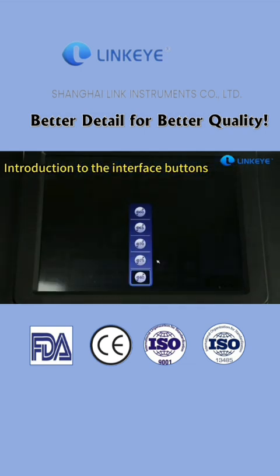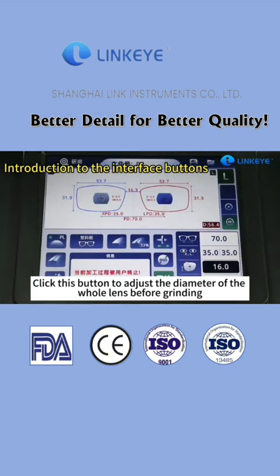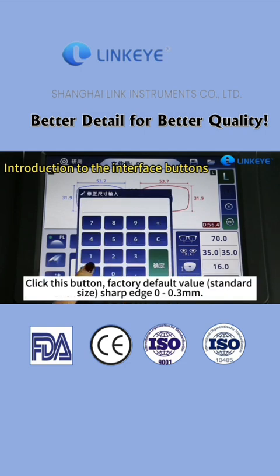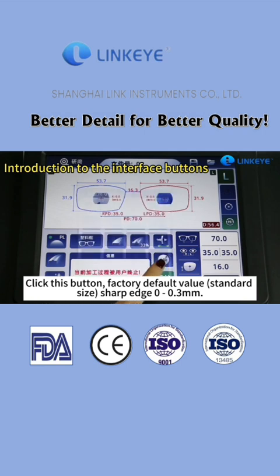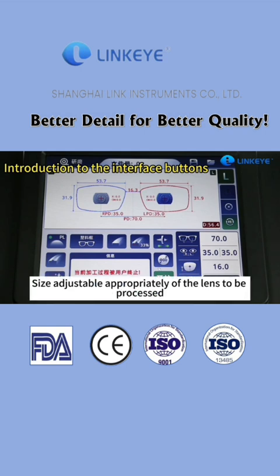Lens diameter button. Click this button to adjust the diameter of the whole lens before grinding. Size correction button. Click this button. Factory default value, standard size. Sharp edge 0 to 0.3 mm. Flat edge plus or minus 0.1 mm. Size is adjustable according to the lens to be processed.